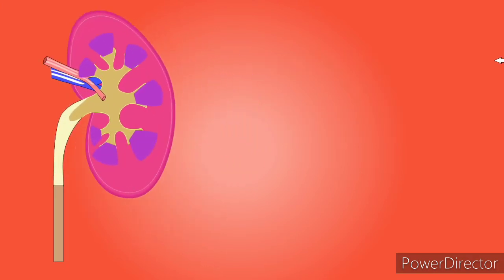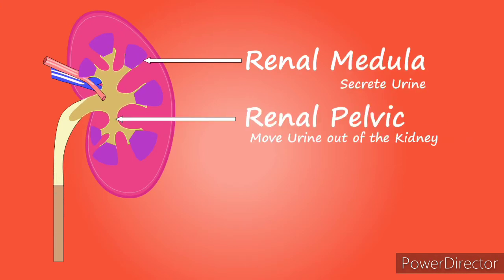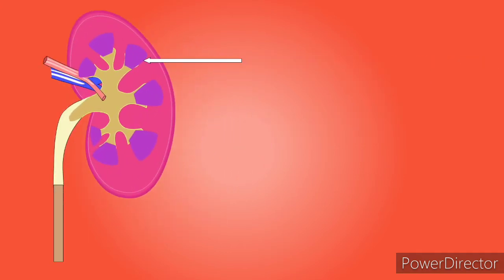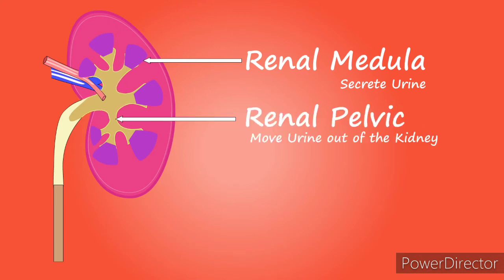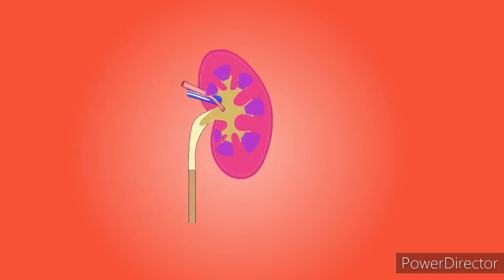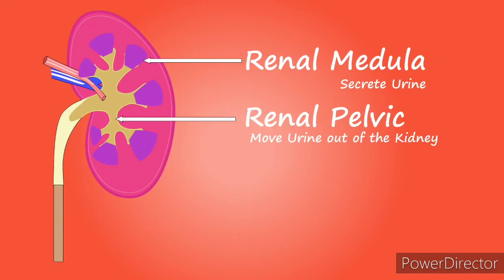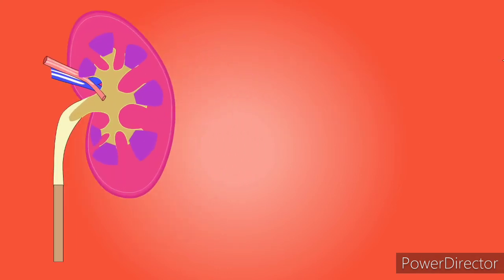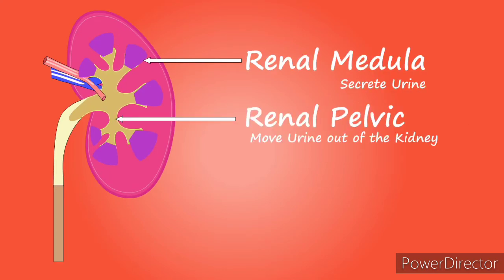Things like red blood cells, white blood cells are being destroyed. Even casts are being decomposed, and if there is glucose in that urine, it will be lost through the process known as what? Glycolysis. So there will also be bacterial decomposition, bacterial contamination. There will be increase in the pH of the urine. So that is why it's good to make sure that the sample is being collected in a chemically clean, dry container and it gets to the lab as soon as possible.